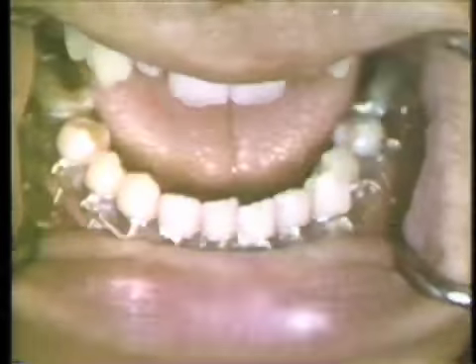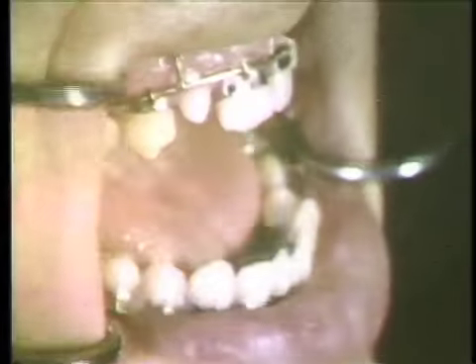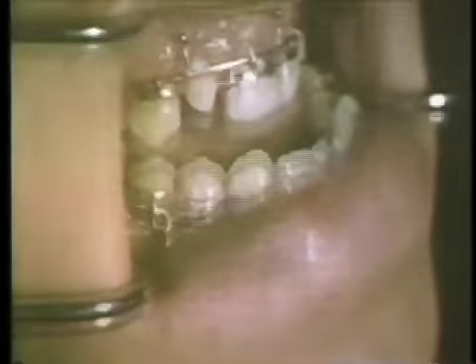Arch bars, in this instance orthodontic appliances again, have been used. The movement is going to be a unit movement of the entire mandible in this situation.